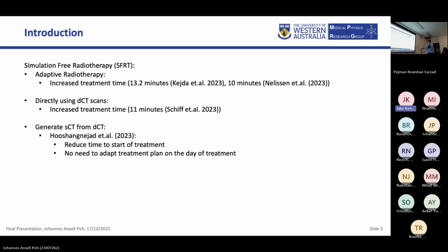Then when the patient comes in for the treatment, the plan is adapted based on the images taken during the treatment. This potentially increases the treatment time because they need to update the radiotherapy plan before they can treat the patient on the day of treatment.